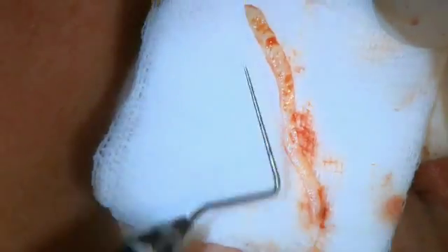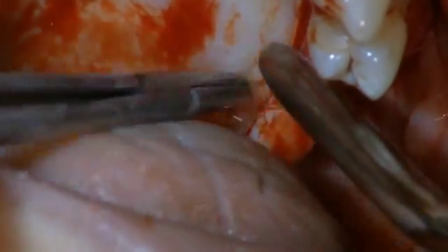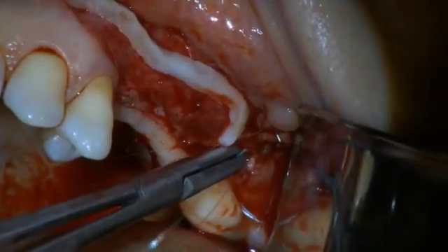The palatal wound is closed using a 5.0 monocryl suture. Approximation of the wound margins is easy since the strip graft was so thin, and it favors uneventful healing.